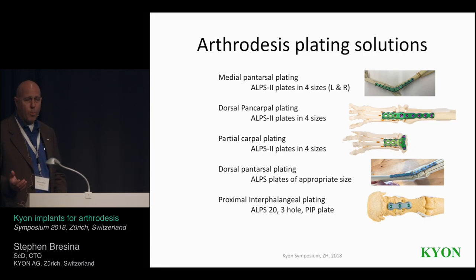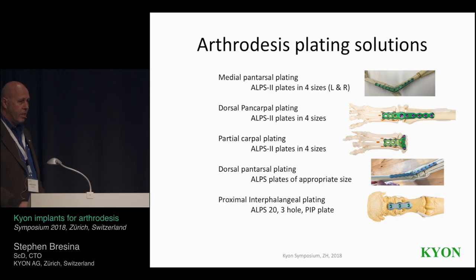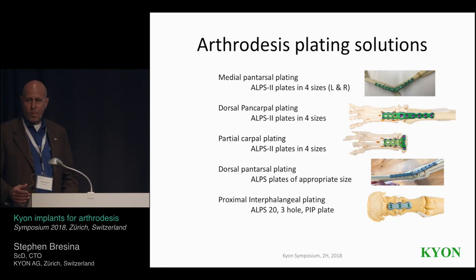We said, well, we have the ALPS system. And Alessandro Piras says, well, the ALPS system is kind of okay, but you have the same size screw along the whole length of the plate. That's not usable for what we need to do here. We also have issues with closing soft tissue. If you have a high plate profile distally, it's going to be difficult to close tissues, so you need to come up with something else.